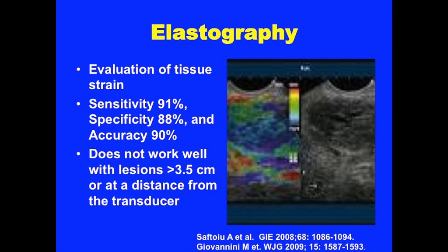Because we're still trying to define where the cancer is in these inflammatory masses, I'm working to try to figure out the big neon arrow that points to where to FNA. A lot of different techniques have been tried.